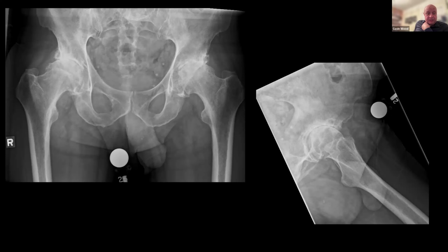So that's what I would do. I would actually do bilateral hips. I'd go cementless on the acetabular side. I'd want to go ceramic because of his age with highly cross-linked poly. And then I would template. And depending on what my templating would be, I'd either go cementless or cemented. And I wouldn't worry too much about the leg length. But obviously try and put them as close to center of rotation as we can. But if I was going cementless, if it's a case of adding a little bit of length to get that, then that's also fine.